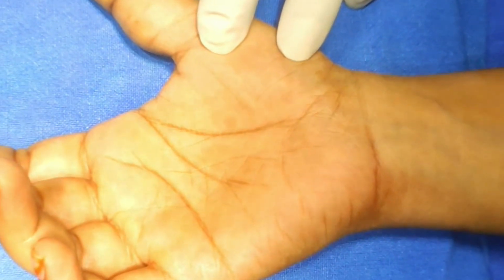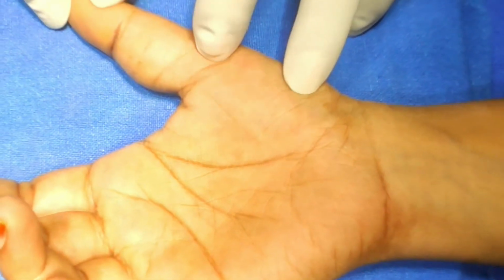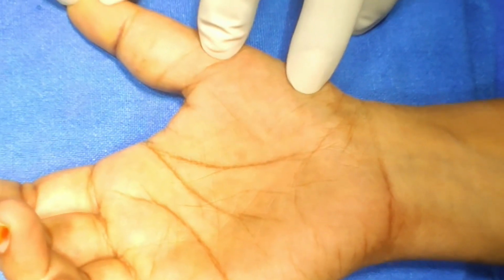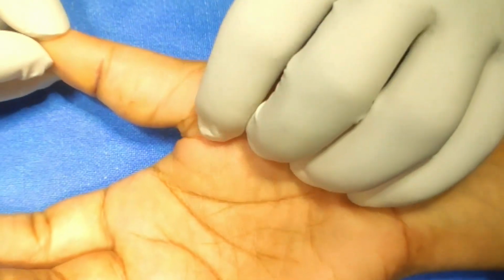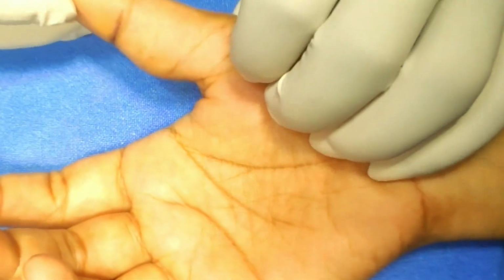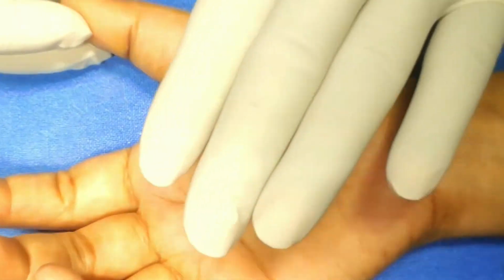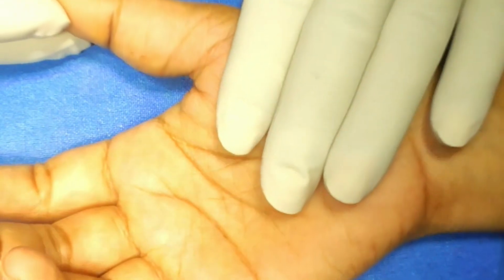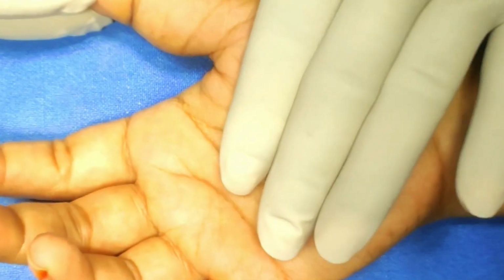This is the second most common tumor of the hand, and most of the time it originates from the tendon sheath. The recurrence in this case is quite high, and the literature says it is from 5 to 50% recurrence. Right? Now, the surgical procedure must always be done under tourniquet. It can be done under GA or under brachial plexus block. In this patient, I have already given the brachial plexus block, and the block is successful.